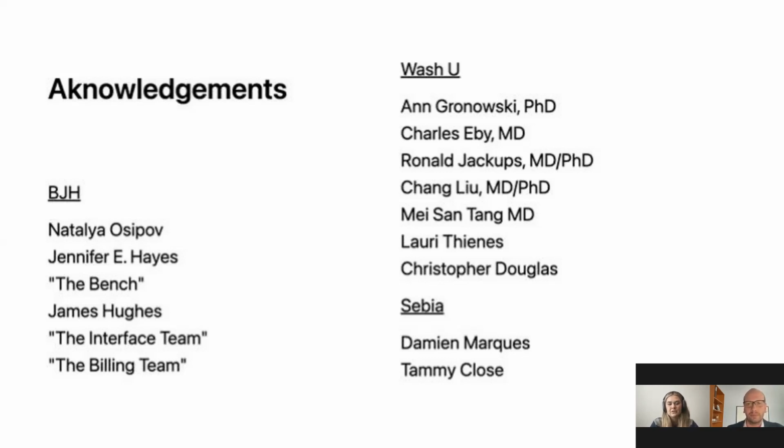Great. Next question here asks, do your pathologists still look at gels or entirely look at scans and chromatograms? What are your thoughts about complete telepathology for protein assessment? Yeah. So we do still look at gels. One limitation this brings up, which should be mentioned, is that the scanned images are not of the resolution that I would be comfortable interpreting for primary diagnosis.